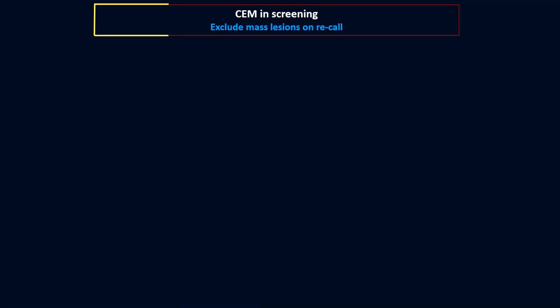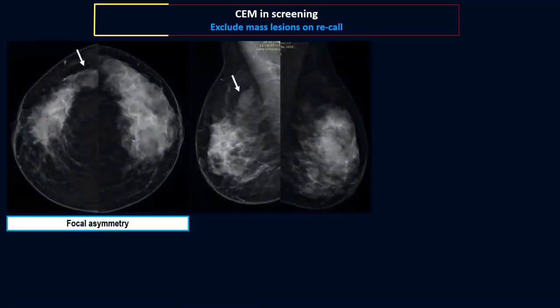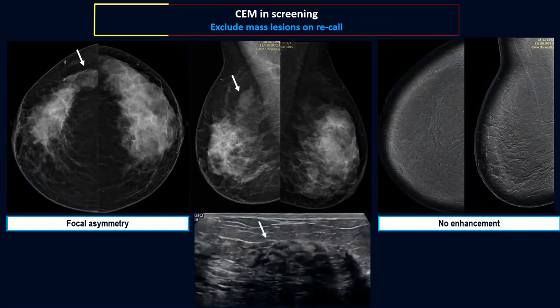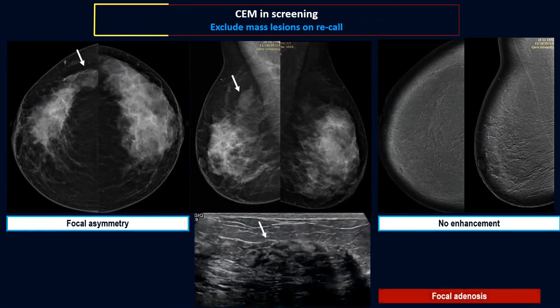Contrast mammography can also be used upon recall to exclude underlying lesions. In this case, we had a focal asymmetry of the right upper outer quadrant. Upon recall, the patient performed a contrast mammogram and there was no corresponding contrast uptake. A targeted ultrasound examination was performed, and this was simply focal fibroglandular tissue — the diagnosis was focal adenosis — and she was put under short-term follow-up.